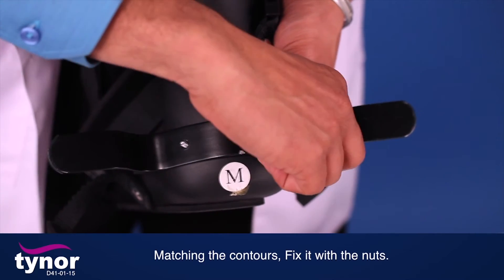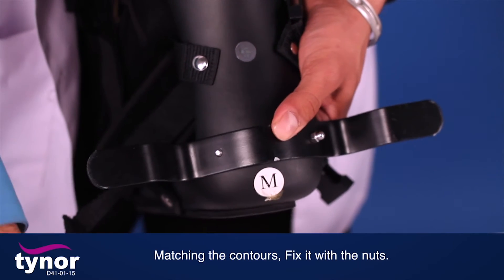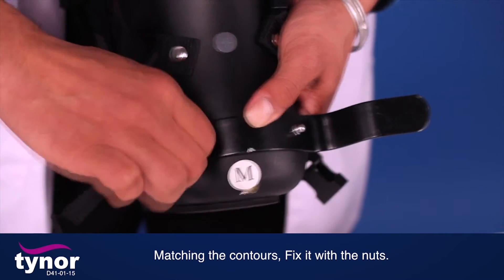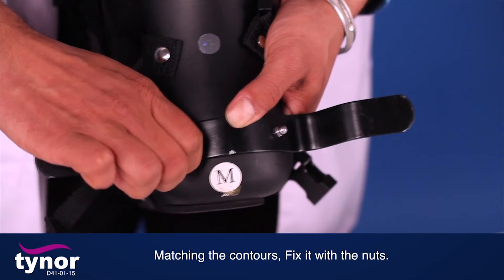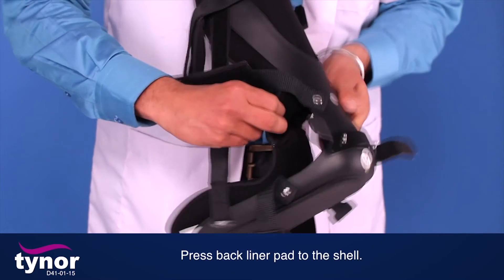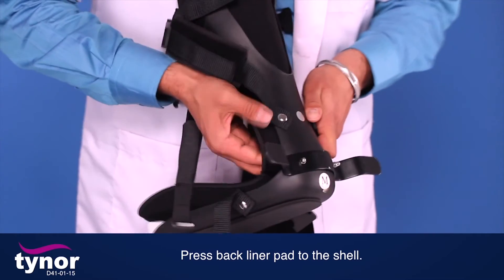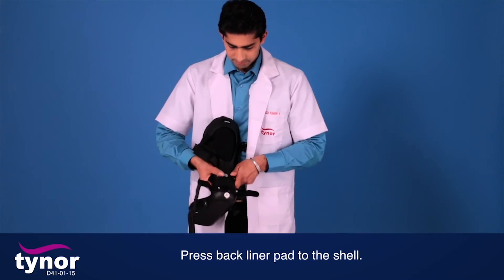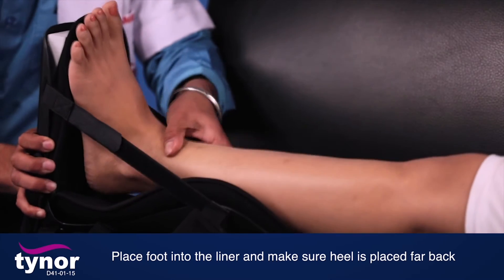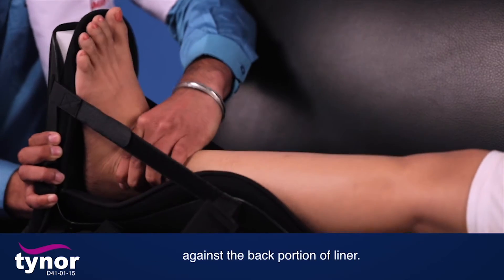Matching the contours, fix it with the nuts. Press the back liner pad to the shell. Place the foot into the liner and make sure the heel is placed far back against the back portion of the liner.